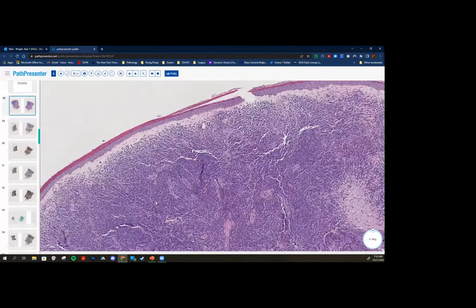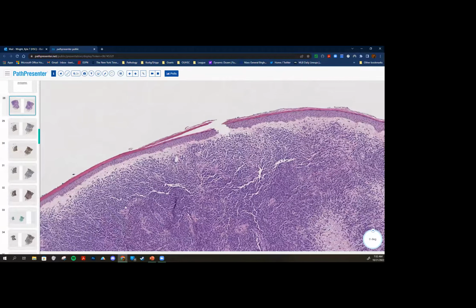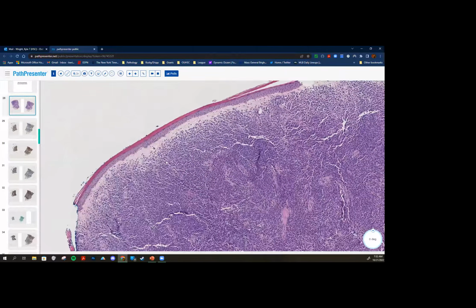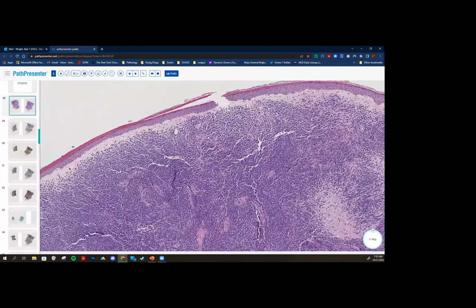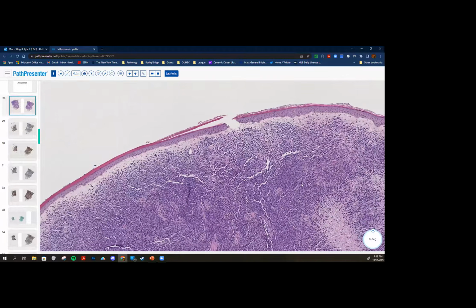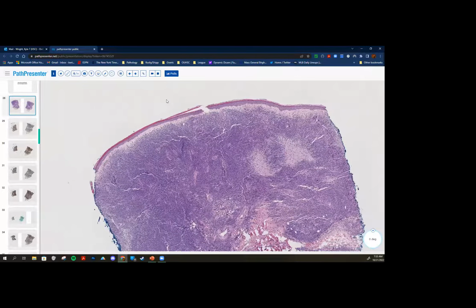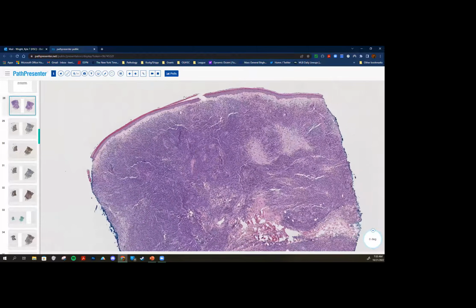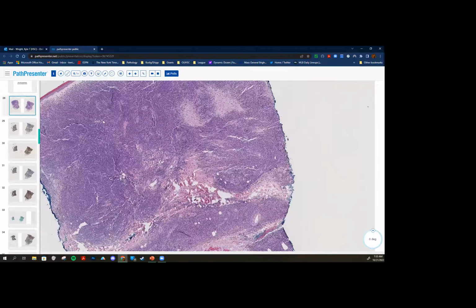So hopefully you can see a similar pattern start to develop with these lesions. So once again, we have a superficial dermal lymphoid infiltrate, preserved epidermis, preserved Grenz zone. So just from the first 3 cases, one being a T-cell lymphoma, one being a B-cell lymphoma, before you've even looked at the immunostains, you should be highly suspicious that this is a B-cell lymphoma. It's come in, it has not gone into the epidermis and has started to grow deep. So I'm thinking B-cell lymphoma before T-cell lymphoma.